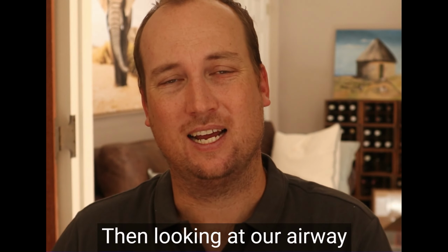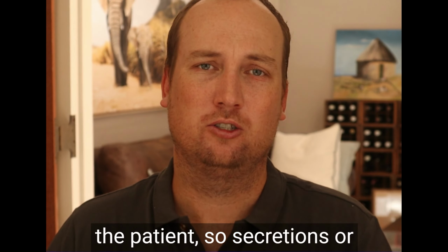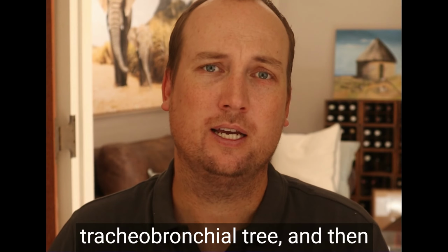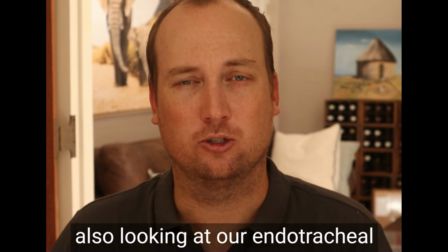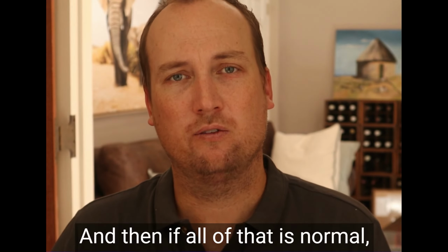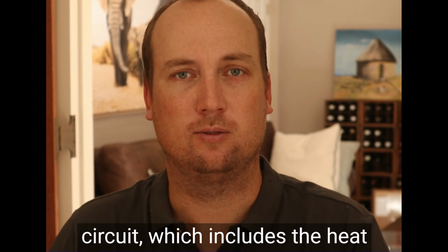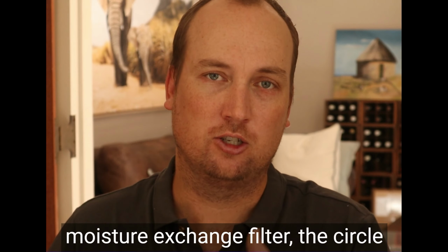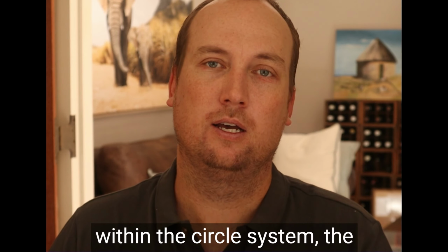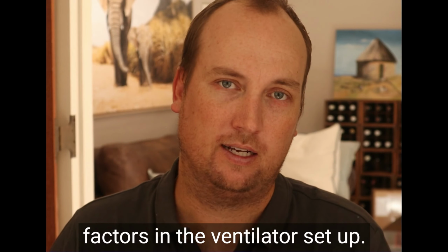Then looking at our airway, both the intrinsic airway of the patient, so secretions or foreign materials within the tracheobronchial tree, and then also looking at our endotracheal tube, whether it's blocked or kinked or malpositioned. And then if all of that is normal, moving on to the breathing circuit, which includes the heat-moisture exchange filter, the circle system, the unidirectional valves within the circle system, the ventilator, the APL valve, and other factors in the ventilator setup.